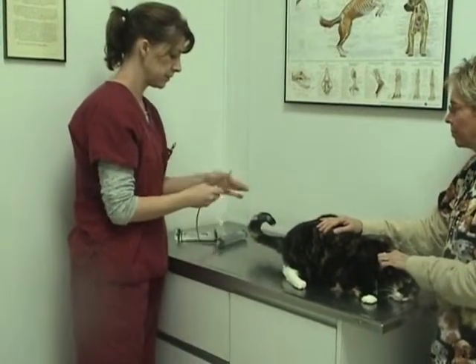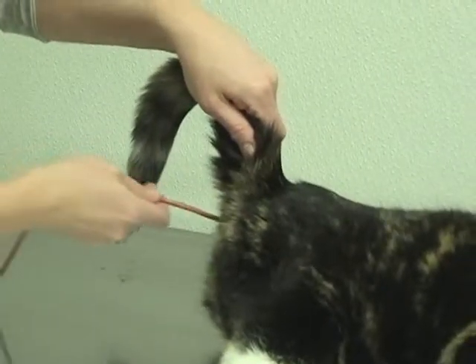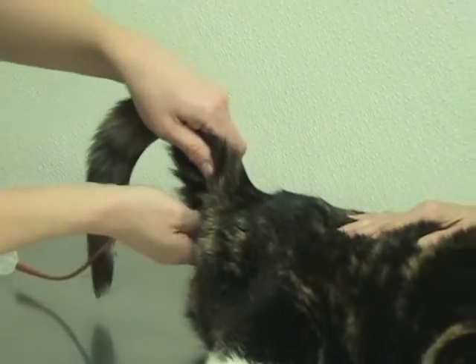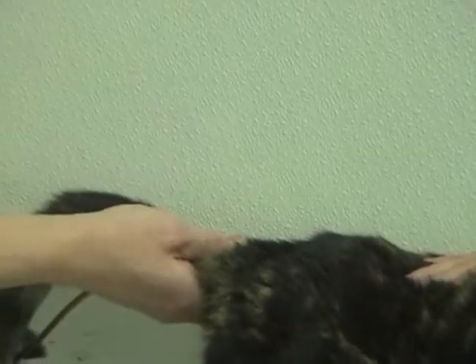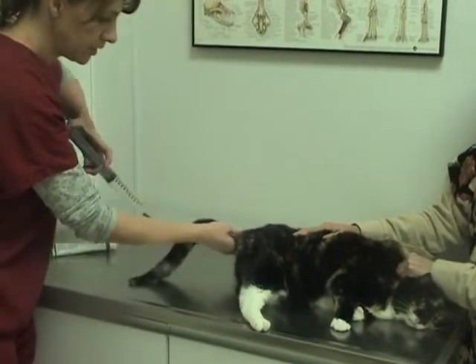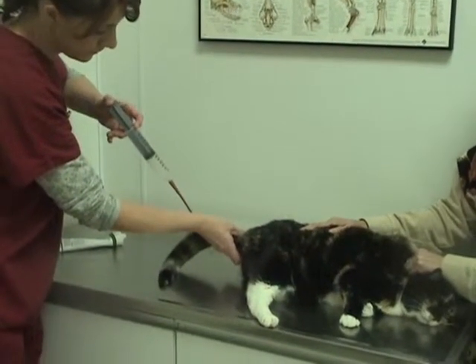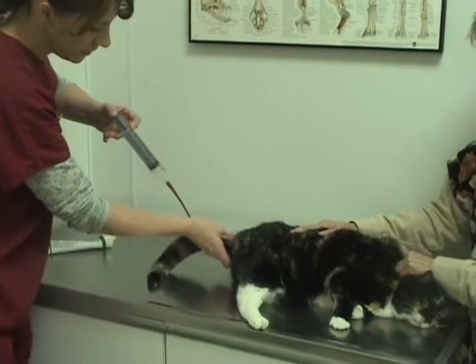Some doctors prefer that an enema be administered to evacuate the colon before beginning the GI study. When giving an enema, make sure to lubricate the red tube for easier placement and comfort for the animal. Place the tube about 2/3 of the way into the rectum and slowly squeeze from the syringe. Our enema is simply water mixed with a tiny bit of soap.